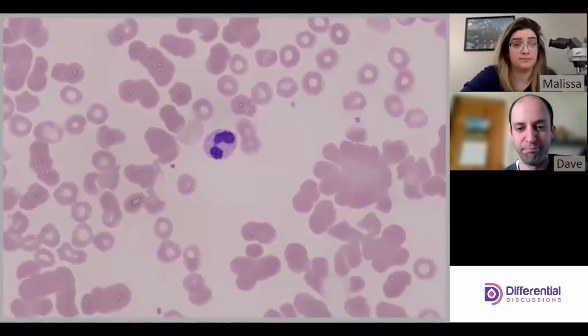And so then this is what it looks like. This is actually going to be maybe a briefer kind of video, because a lot of the morphology is hidden from us, isn't it? Yeah. You can see that there are some normal red cells here, and they do look like they have 1/3 central pallor. So they do look relatively normal, the ones that we can see.